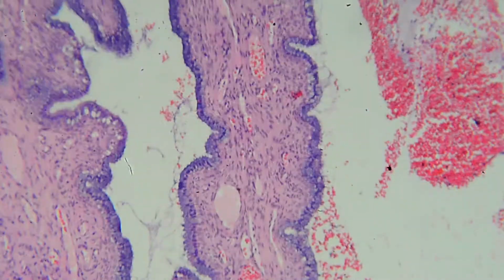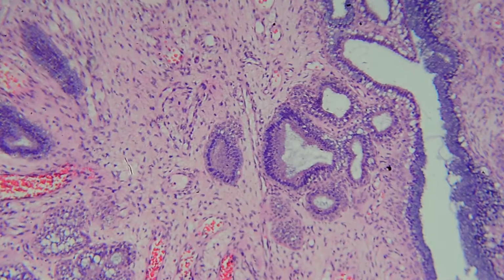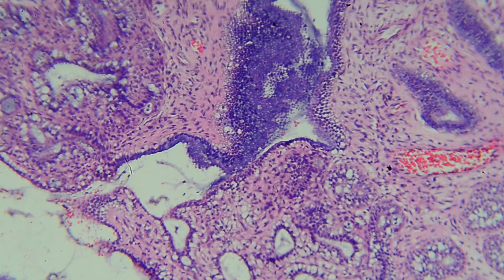That's about it. It doesn't mean it's pathological, because there's always bacteria coming up. So that's normal, it's why it's normal to see a lot of inflammatory cells down there.